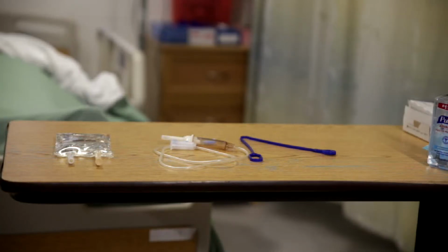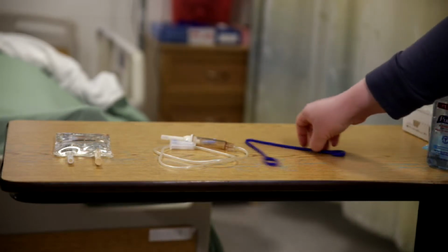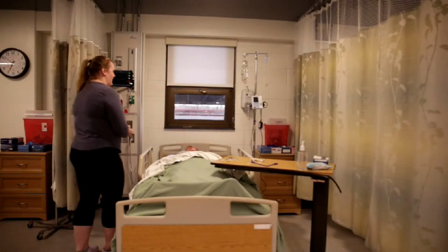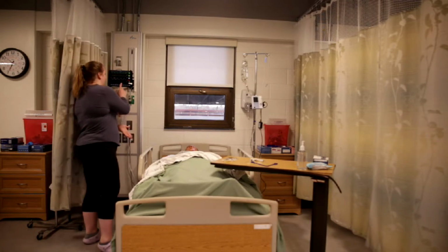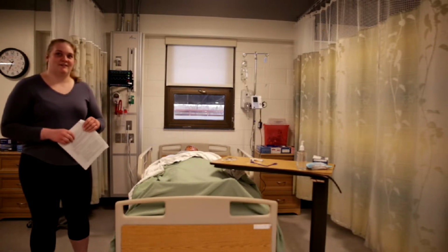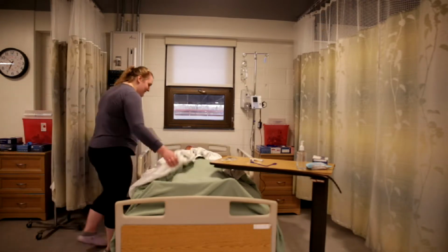Okay, so for piggyback IV, I'm going to need my secondary tubing and then my piggyback medication, and the thing to hang it from. Perform hand hygiene, 60-second assessment, assessing airway, breathing, circulation, tubes, lines, drains, and the safety of the room. ID your patient, and then check the vitals.